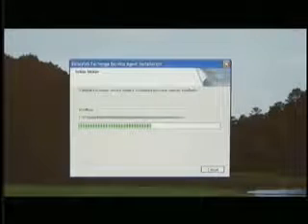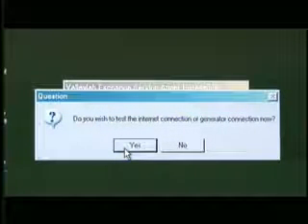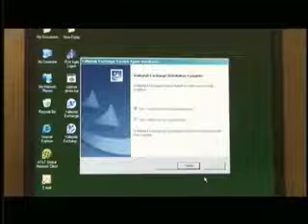Included in the Valleylab Exchange Service Agent software is the Valleylab Exchange Software Update System Connection Tool. This utility gives you the opportunity to check the communication link between your service PC and the Valleylab Exchange Software Update server. This screen will appear during the installation phase of the Valleylab Exchange Service Agent software. Selecting Yes will take you to the testing screen. Selecting No will complete the installation of the Valleylab Exchange Service Agent software.